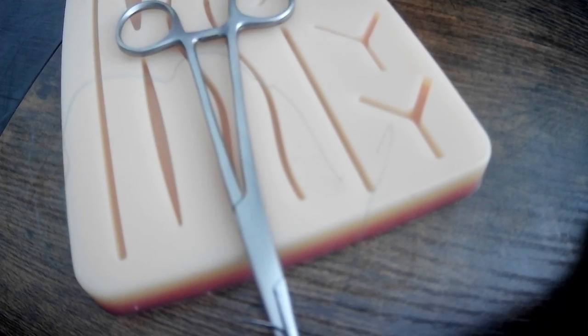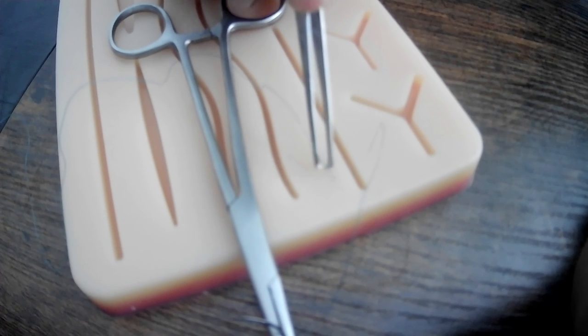If you can see this black, let me move this out of the way. Okay. The camera sucks. Yeah, as you can see, the string thing, that's the suture. So I drove it through here. I've got to be careful not to hurt myself. So I drove here in this location. The camera is so bad. Okay, so I drove it here.